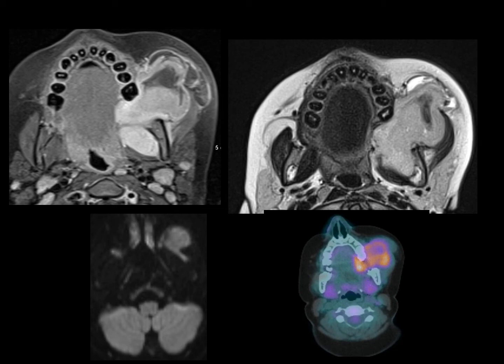So remember, when we are dealing with head and neck problems and scalp-based problems, we need T2 STIR, so with fat saturation, normal T1 because we use the fat signal as a passive contrast, and post-contrast T1 fat saturated.